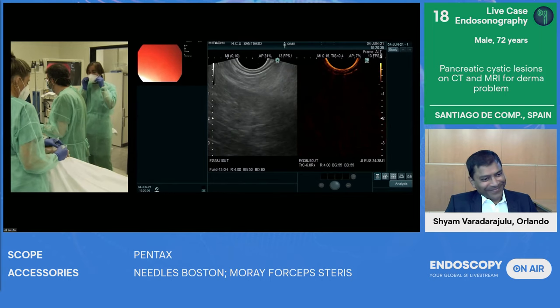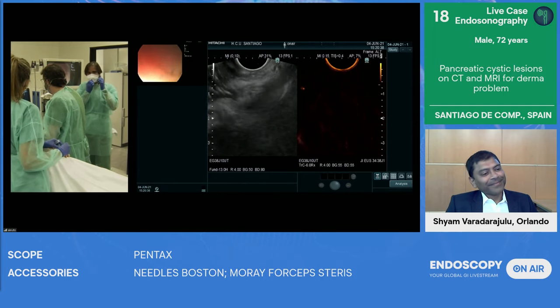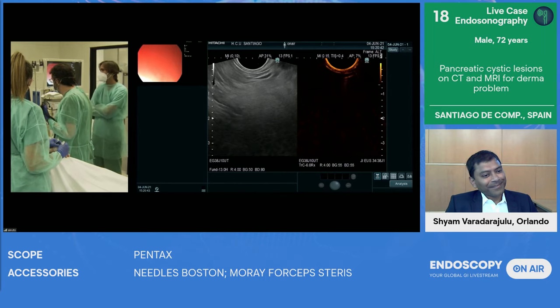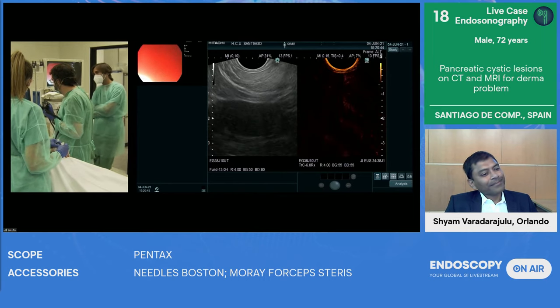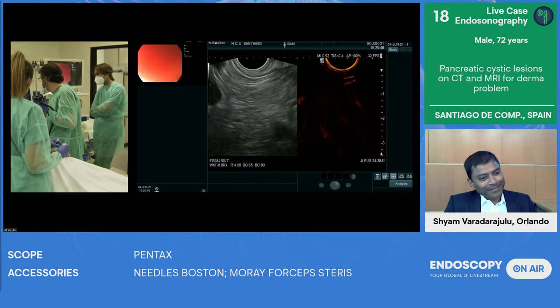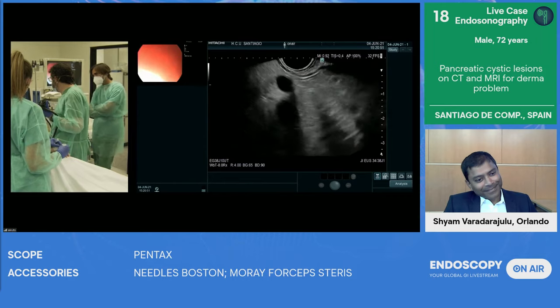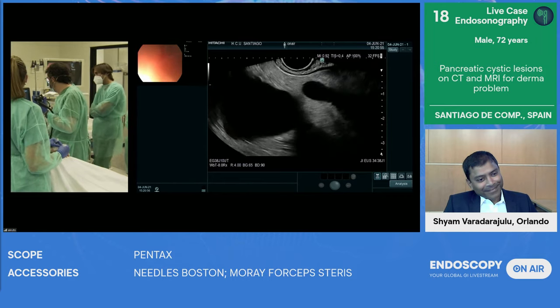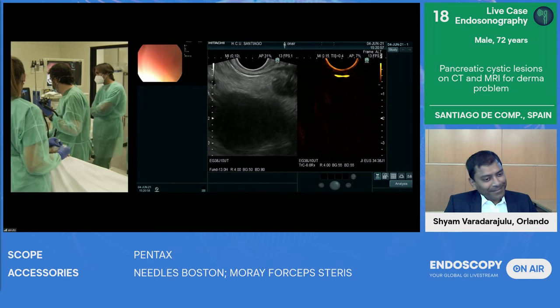Of course. Espera que hemos perdido el. The patient just breathed and we just missed the lesion. Okay, let's try to find it again just for a second. Okay, aquí está.